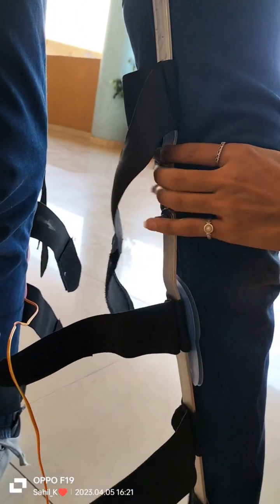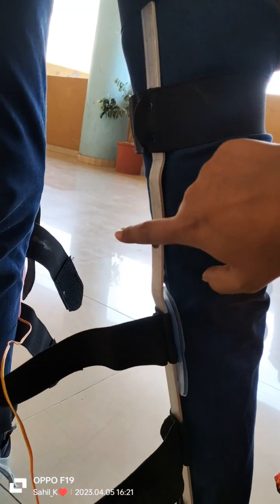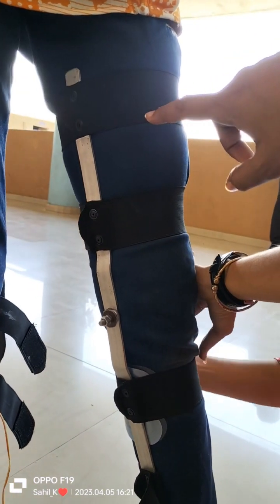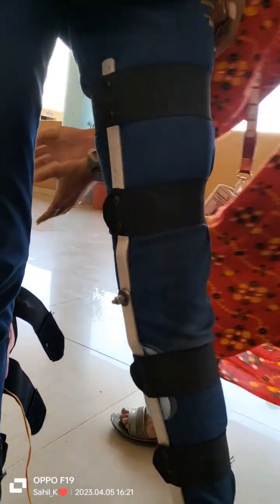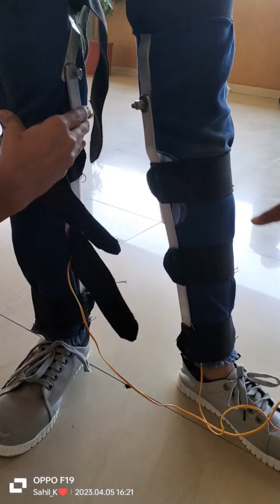These are the commercial high-graded aluminum sheets which are connected by 6mm nut bolts and have the elasticity to produce adjustability for the person. It can be adjustable for any person who is able to use it. These are connected with any removable shoes — the patient can use any shoes whichever he wants.